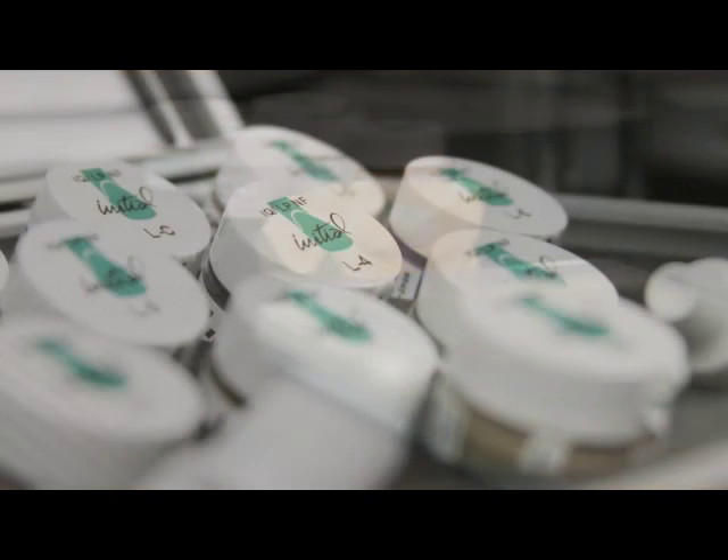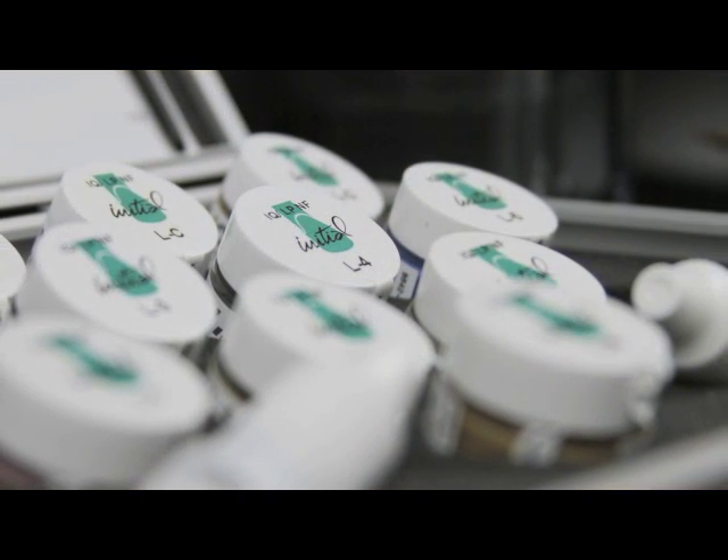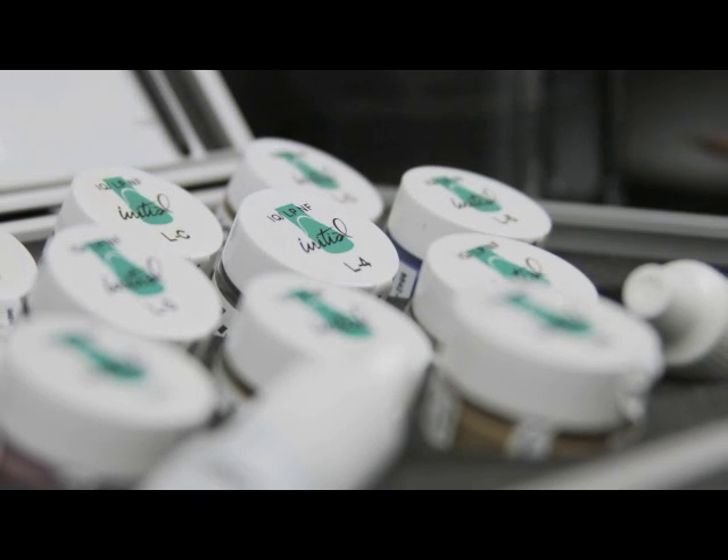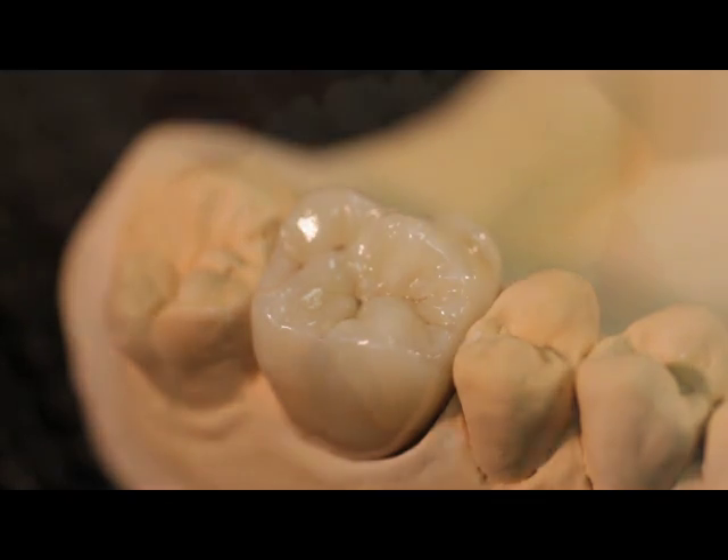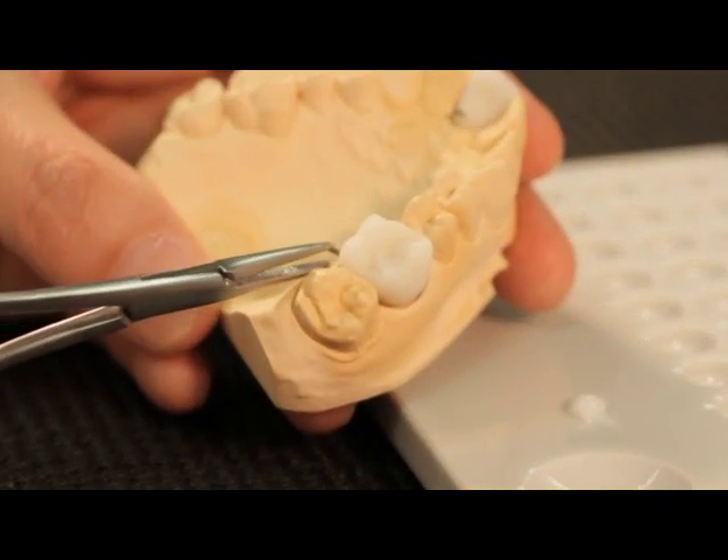Available in a ready-to-use consistency, the Lustre Paste NF are based on fine ceramic particles and can be applied in a thicker layer, where they will exhibit unsurpassed vitality and a very natural glaze to your restorations.